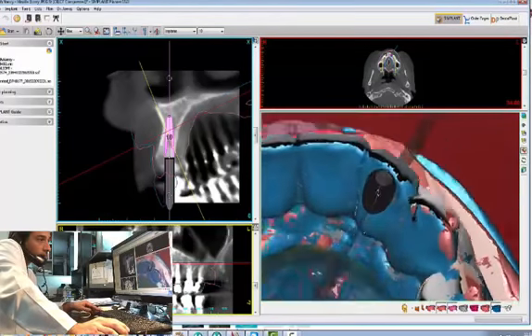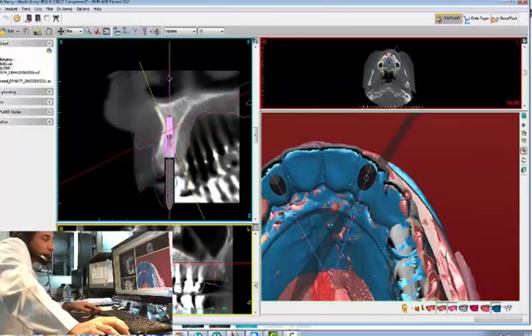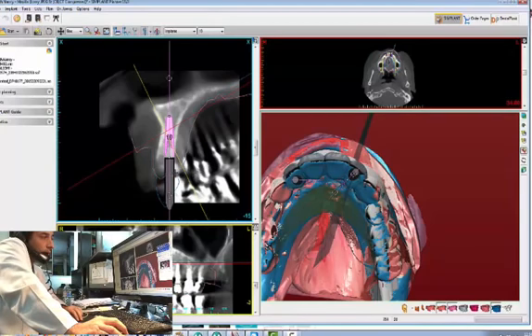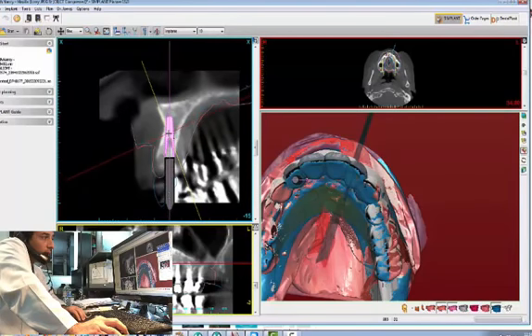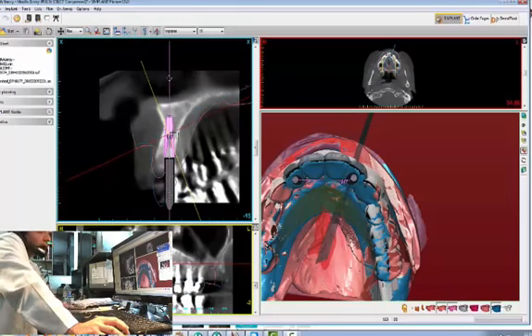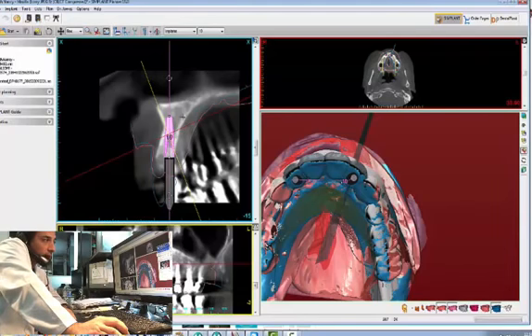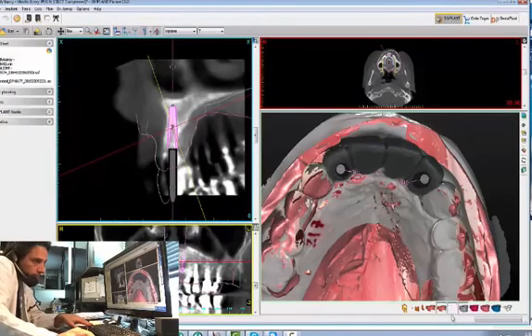What do you think about number ten? If you have any comments, let me know — that's why we're doing this together. To make it more like seven, I can increase it in two ways: I can either tilt the implant to the palate, or I can move it bodily a little bit. But we have to place the implant within the confines of the bone — that's what the anatomy plays. I think that's a little bit better. Now you can see the actual wax-up — it's much, much clearer now.